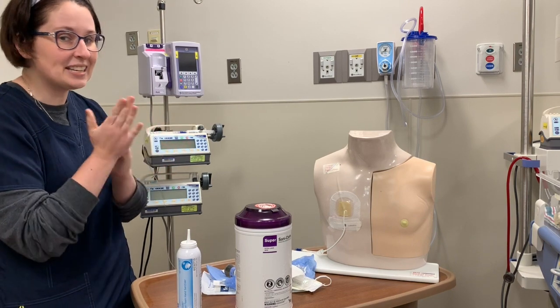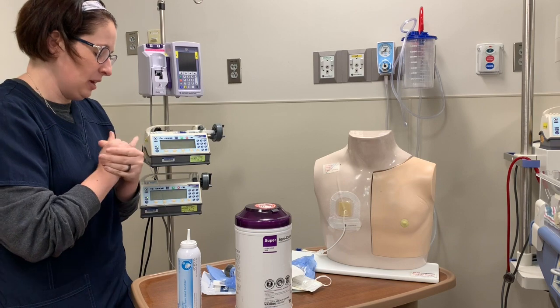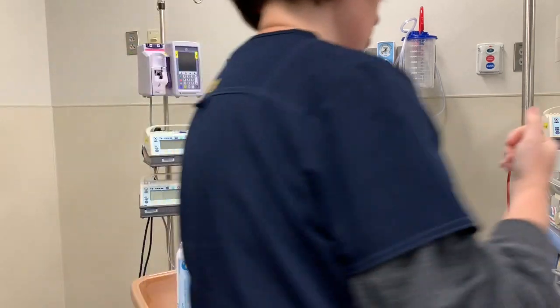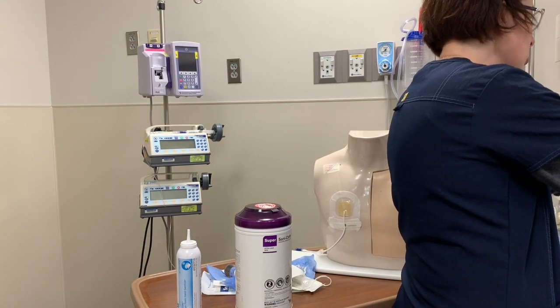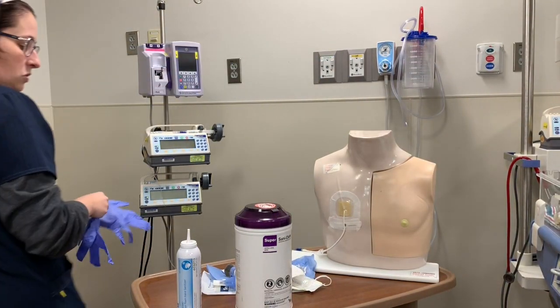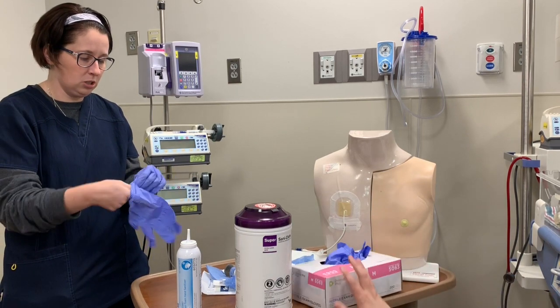Hand washing is the key to success. I'm going to put on some gloves so that I can disconnect this tubing from my patient and put a red cap on it. Since I'm disconnecting the tubing and putting a red cap on it, I will need to relabel this tubing to expire within 24 hours if it is not already marked to do so.